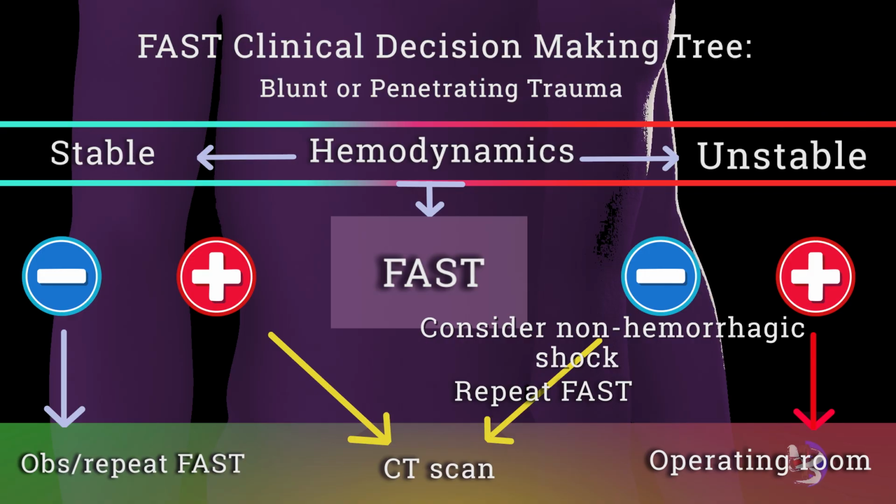Any of these has to be driven by a particular clinical circumstance. Clinical suspicion, mechanism of injury, and a change in the hemodynamic status of a trauma patient should take precedence in deciding on further diagnostic testing in patients with a negative initial FAST test. For the perioperative period, it is important to note the relevant past surgical history, since this may have an influence on our decision tree algorithm. Such is the case for patients who've had nephrectomies, splenectomies, or have a VP shunt, for example.